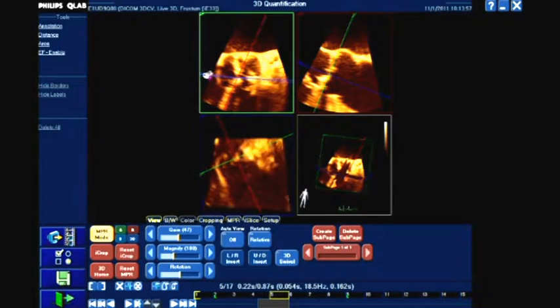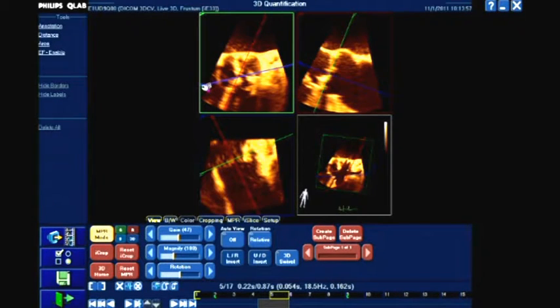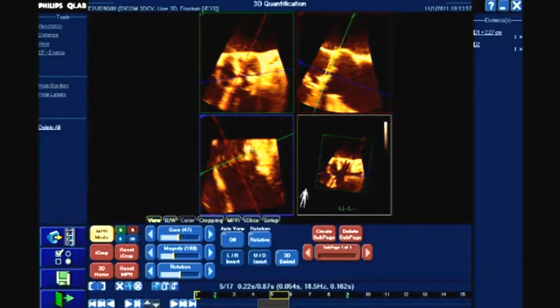And then we can do the same with the blue until we end up tangentially across it, which you can see here. And I'll do this in multiple different planes, adjusting both its position and also its angulation across the valve, which is what I'm doing here, just looking at it and assessing it as we go. And I'll just make a couple of measurements from an illustration point of view. So again, we can make measurements there. That's come up at 23 millimeters and across here. And again, that's come up at 23 millimeters.